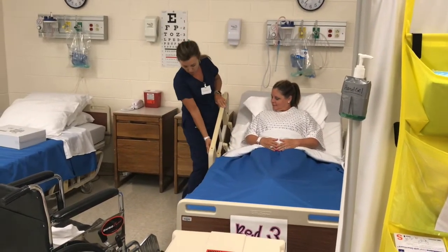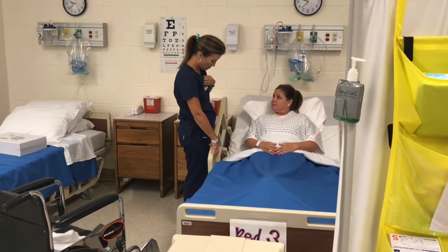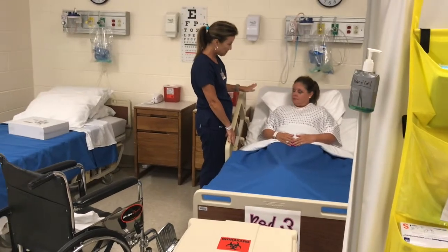Put the side rail up. Make sure the bed's in the lowest setting. Do you know how to use the call belt? Yes, I do. Are you comfortable? I am. Do you need anything? No.